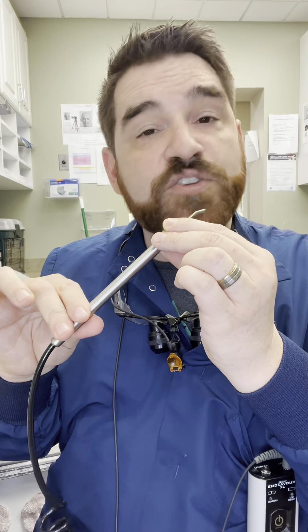This is an electric pulp tester. It works by using an electrical charge to tell you if the nerve is functioning. A nerve that is working will actually conduct an electrical charge, and that's what this detects. First we use a little bit of toothpaste on the tip and then place the tip onto the tooth that we're testing.